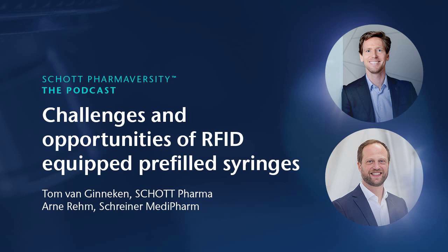Yes, sure. So first of all, RFID stands for radio frequency identification. It's a wireless technology that uses radio waves to transmit data between a device and a tag. There's a lot of technology behind it, but I think that's the basic thing to know. When a tag comes within range of an RFID reader, it sends a signal containing a unique identifier and often also additional data to the reader. This data can then be used to identify and track the tagged object.